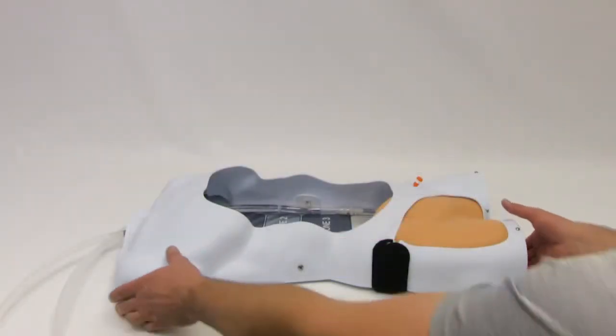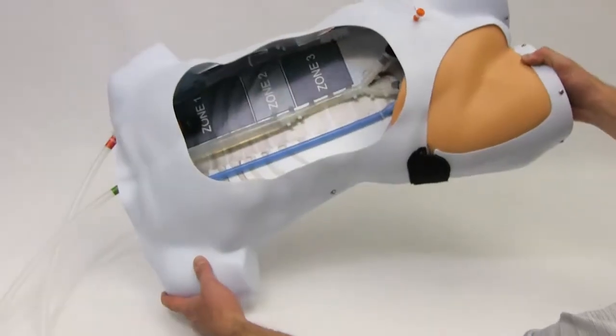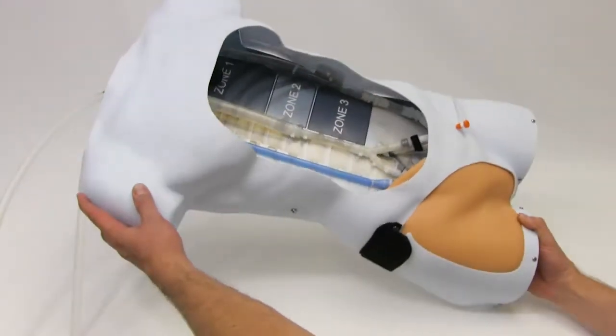Purge air from the tubing by lifting the model back and forth. This will give air within the tubing a path to escape.